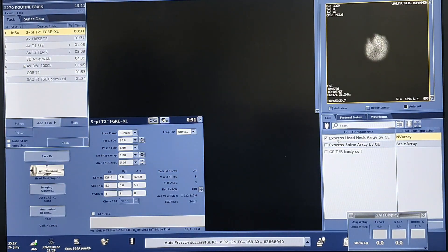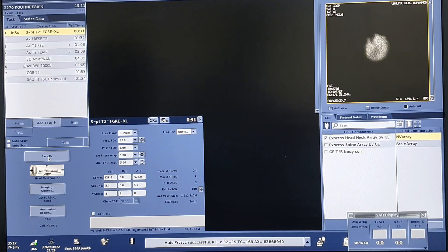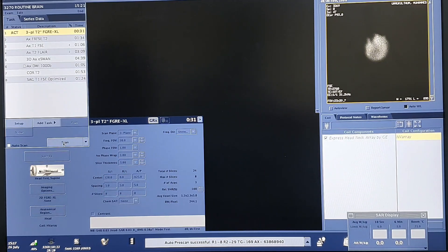Then we will check if our coil is the right one. I am using an Express Head-Neck Array coil by GE and I am using the NV Array — this is the one I want to use for the brain. So I am okay with the coil. I will come over and save. I am going to take the localizer, or the scout — save it and scan. The total time for all the sequences we have here is going to take 15 minutes and 21 seconds, though it also depends on the extent to which I plan it.